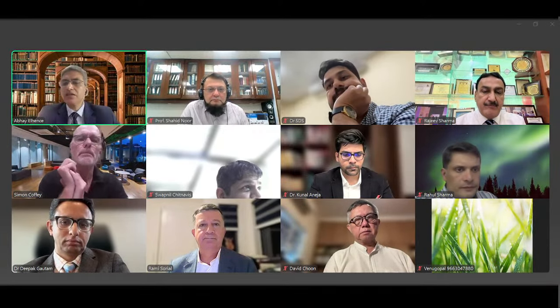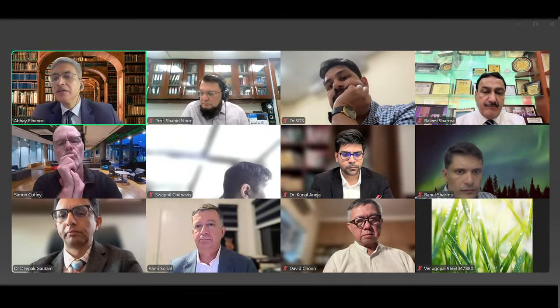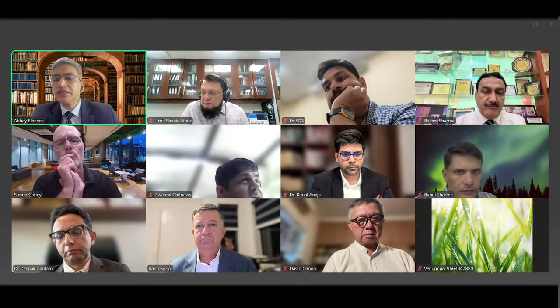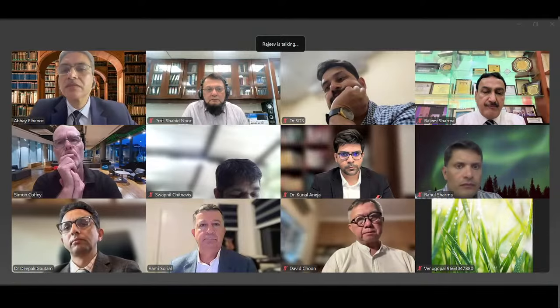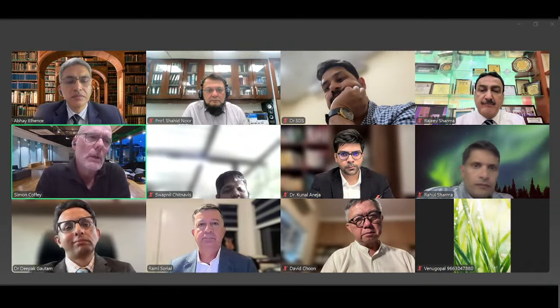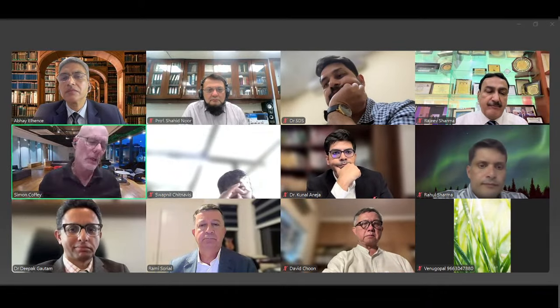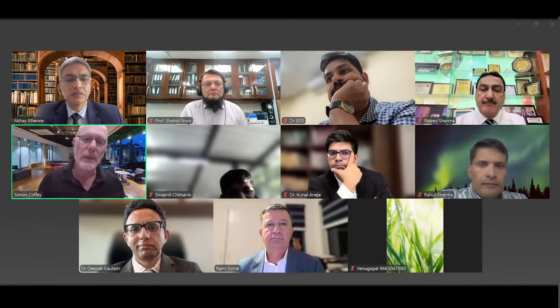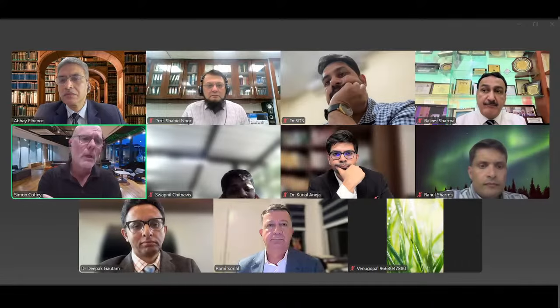Great. So one last question to you, Simon, before we go to Dr. Deepak. What would be your quick surgical tips to avoid subsidence when you're doing a stem? Yeah. Well, that's almost a question of how hard do you hit it. I think templating is a good start. You really do have to do good templating.